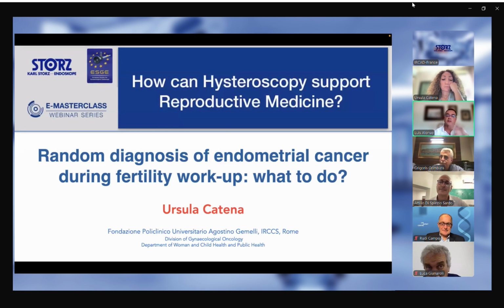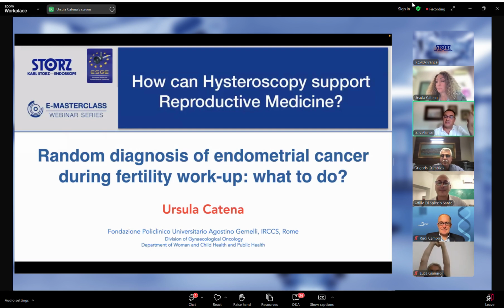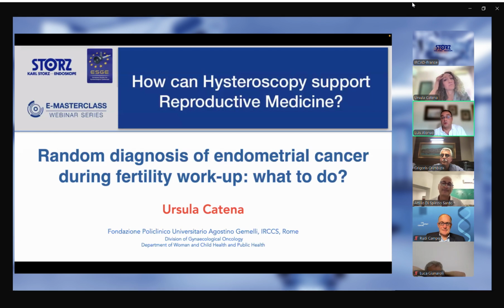So yeah, I think that we have to try to find the best tool for the different conditions. So the shaver, I think it has its indications that are great, but probably this is not one of the indications for the shaver. Of course, you can resect the lower arc with the shaver, you can do it, but you have no way to fulgurate all the tissue that you have in the dome of the defect or the tissue that you have in the lower part. So you can use the shaver, but probably you have to use another tool to fulgurate the tissue, that will be a mini resectoscope.